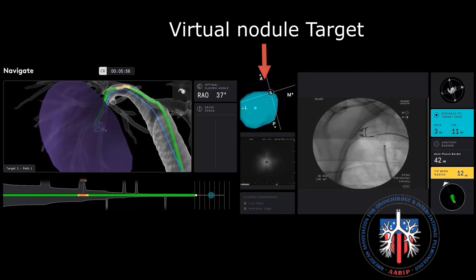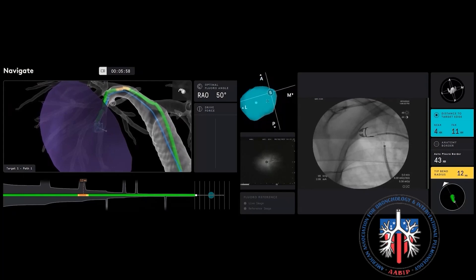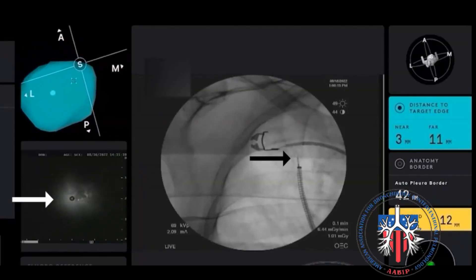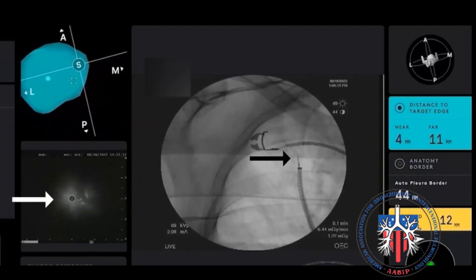Adjustment of the tip of the robotic bronchoscope with radial ultrasound can help achieve a concentric or an eccentric radial ultrasound signal.